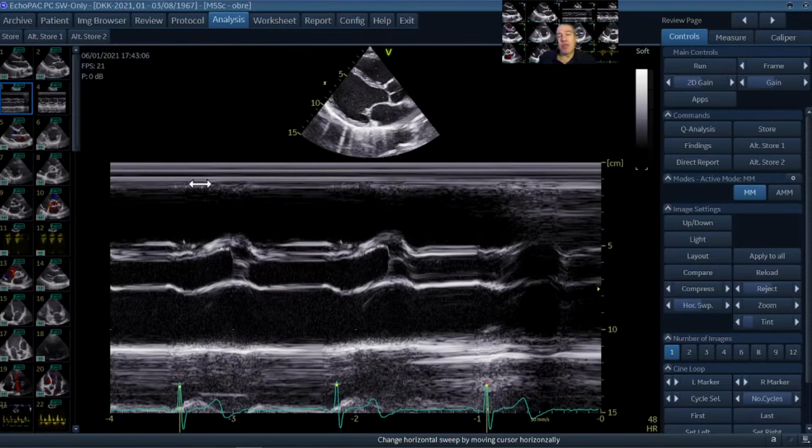I just want to show you here, this is a traditional way how to measure left atrial diameters. This is the M-mode. The M-mode now here is placed across the aortic valve or the left ventricular outflow tract, and we try to capture here the largest diameter of the left atrium. As I said already, I typically do the measurements in the 2D images nowadays, but some echo labs still stick to the traditional M-mode if they get a good recording.